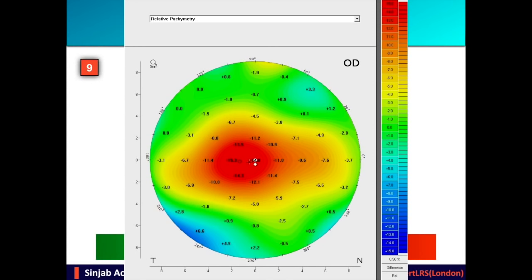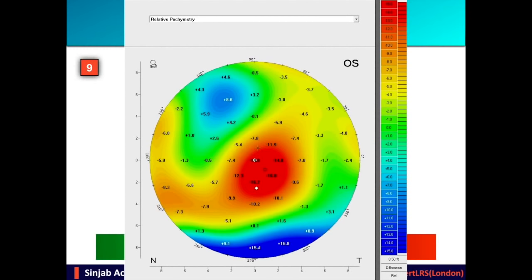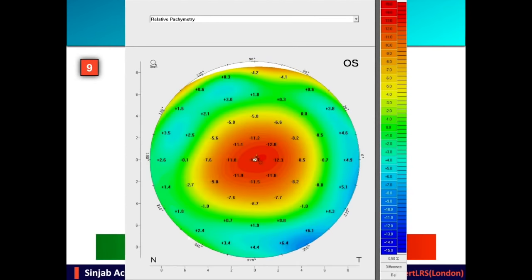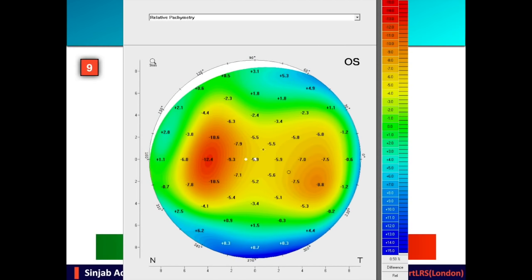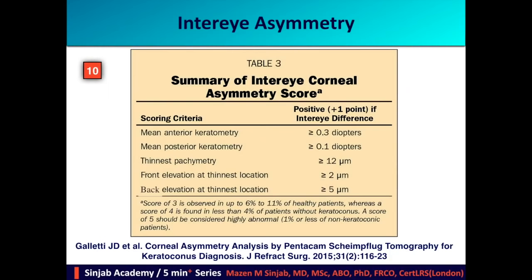Some patterns on the relative thickness map include keratoconus, which is irregular with a very thin cone shape. The disciform pattern is characteristic of post-myopic laser vision correction, while the annular pattern is characteristic of post-hyperopic laser vision correction. The last point of the PS3 system is inter-eye asymmetry, where we compare both eyes based on five parameters as shown in the table.